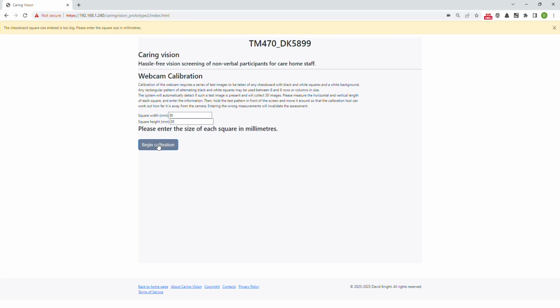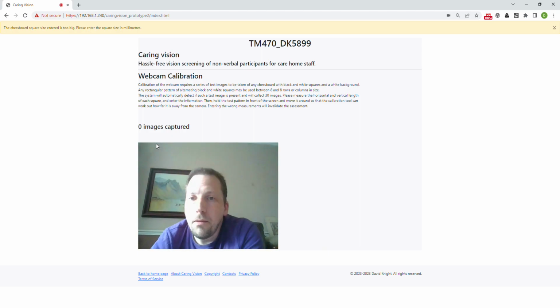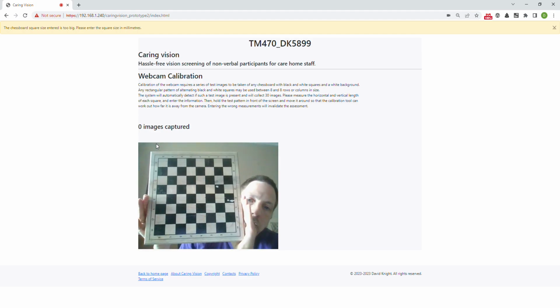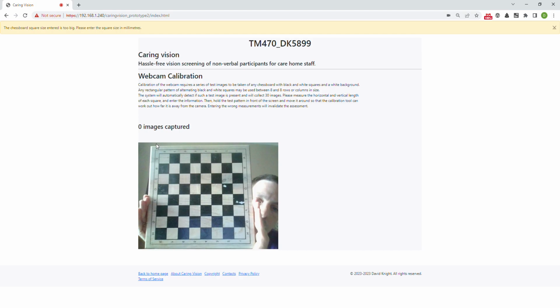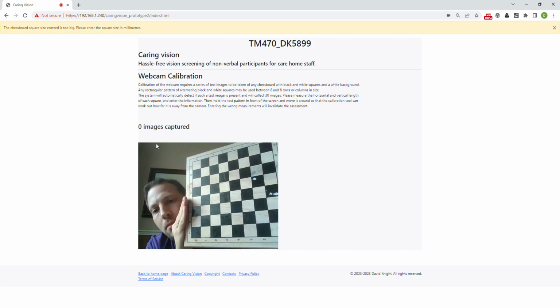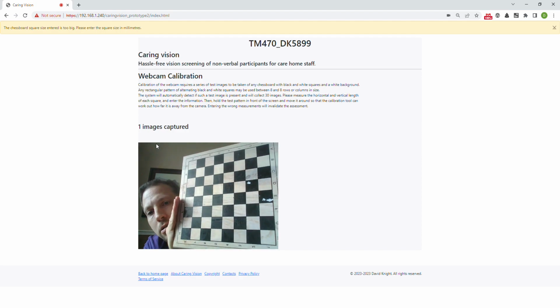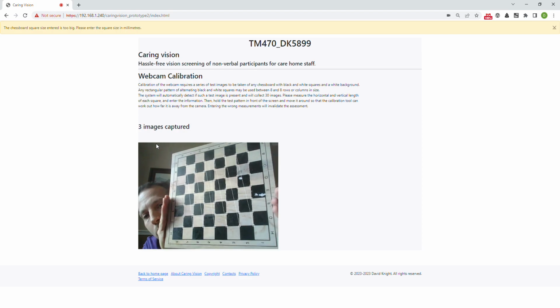So we're going to begin the calibration now, and again, it's going to come back to an image of me, and it's going to ask me to hold the chessboard up in front of the screen and move it around. So that's what I'm going to do. So that's my chessboard, and that's lovely. So nothing much is happening at the moment, but you can now see some lines have appeared on the chessboard. As I move it around, you'll see they appear more and more.